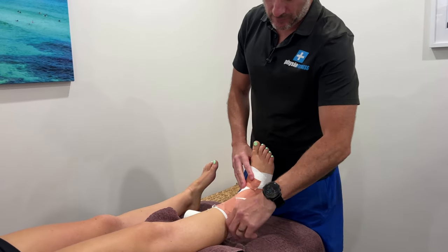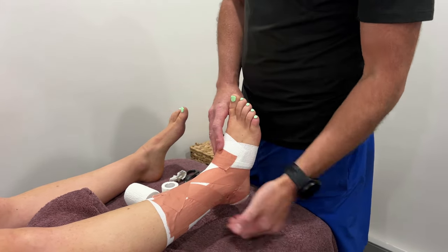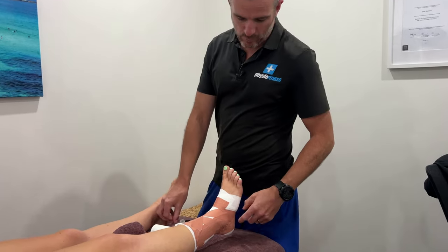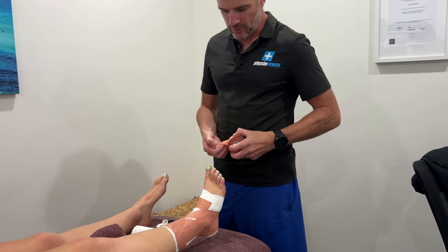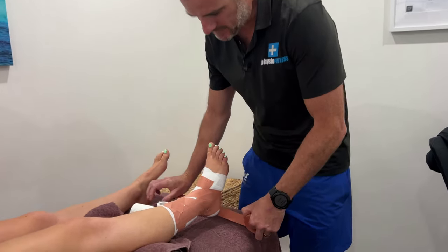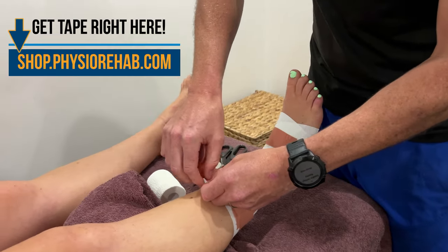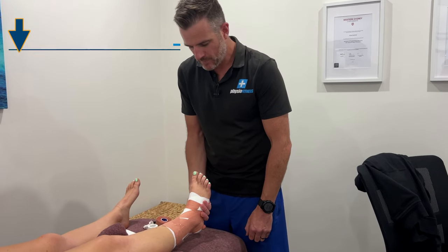For really unstable ankles, you can double up the lateral J-lock by overlaying another one on the same line. Some people find that a bit over the top, but for someone who needs a lot of lockup it's a great addition. Once you've done that, lock everything off at the top — you don't really need to lock off the bottom, it's the ends at the top that matter especially when putting on pants, shoes, or tights. That closing anchor stops everything rolling down. And voila — there you have it: a classic ankle taping, biased to the lateral side to stop inversion movement.